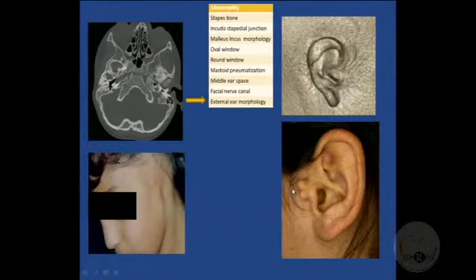get the 3Ds of your external ear, the skin rendering. It's always useful. The clinicians, they see their pinna. You don't have to tell them the pinna is deformed because they can see it. But if you don't mention it, it looks bad on our part. So it's for completion's sake, but I always suggest it, it's just like one click for the technicians just to add a 3D reconstruction.